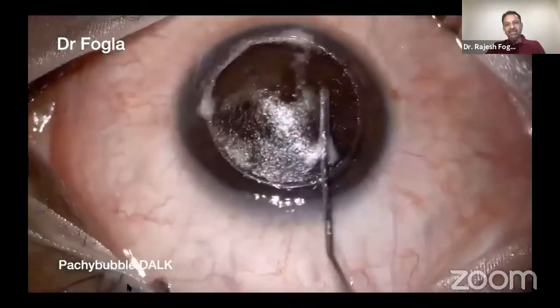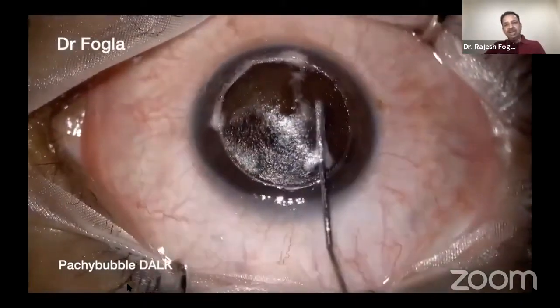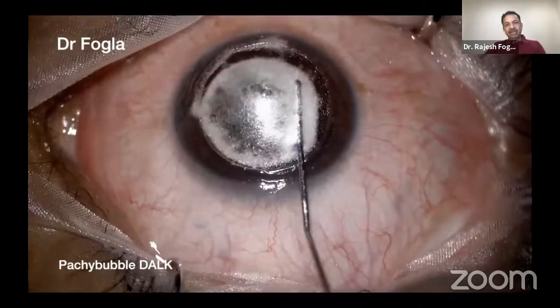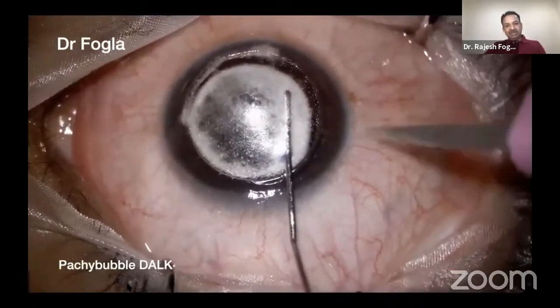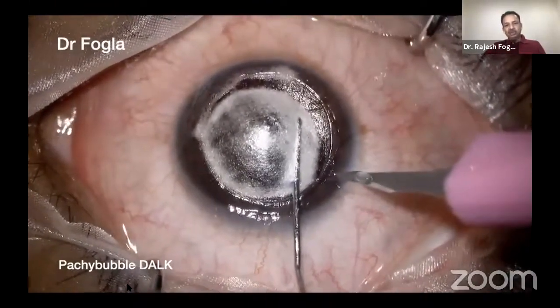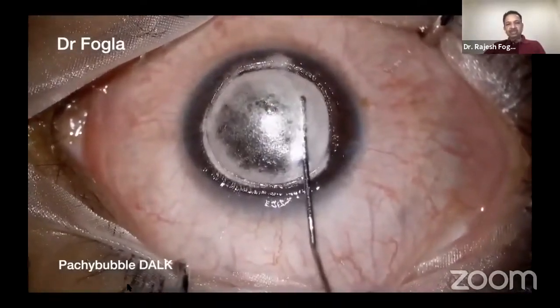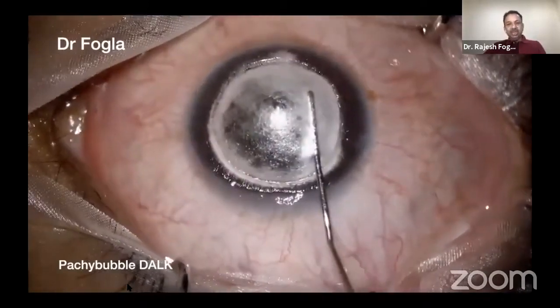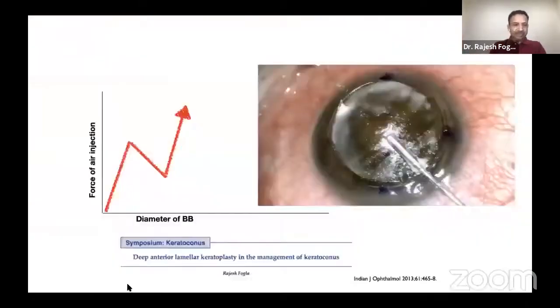The advantage of this technique is that with the diamond knife, you can go up to 90% depth and make the track, and you can be more consistent in achieving the big bubble. I've done that. The only problem is that sometimes when you set the diamond knife to 90% depth and press it a little bit more on the cornea, it can go through and through because it's so sharp. If you keep it at 80%, then sometimes it does not go as deep. So I think this also has a learning curve for which you will need some amount of practice, but this is another technique which can definitely be explored.